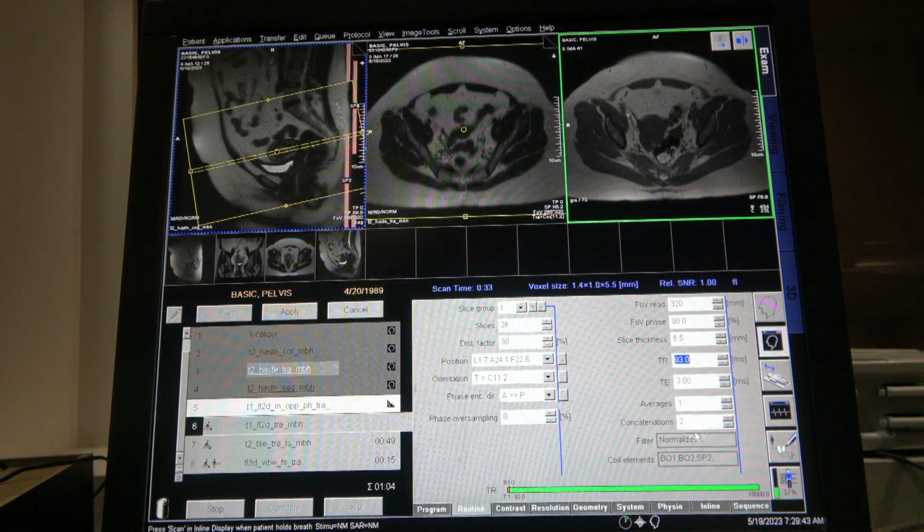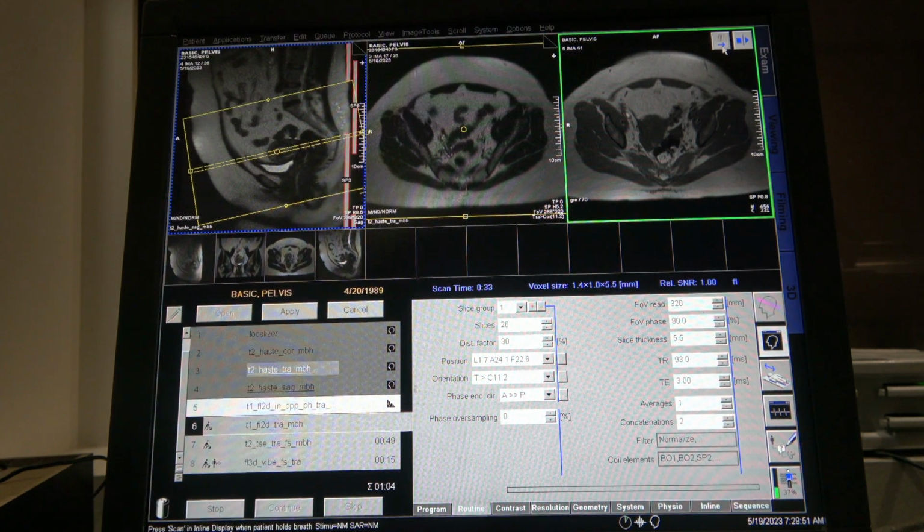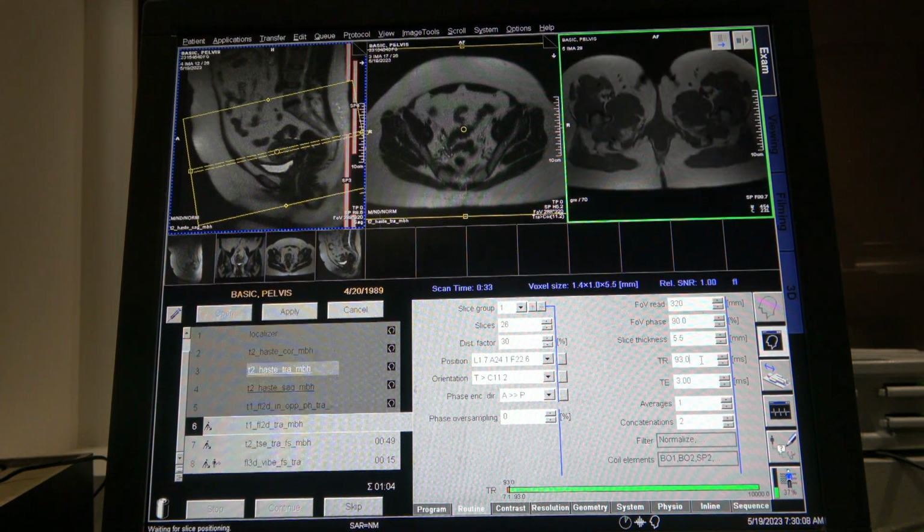So this was 2 concatenations, so there's going to be 2 breath holds. Hold your breath. Breathe.